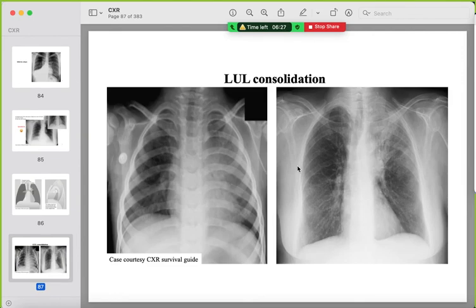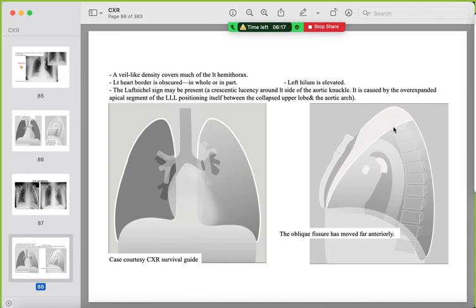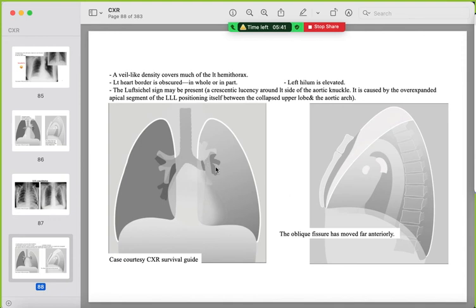Left upper lobe consolidation shows air bronchograms with no signs of collapse. Signs of left upper lobe collapse include a veil-like density over the whole left lung, loss of the left heart border, and the aortic knuckle surrounded by an air lucency (hyperlucency of the left lower lobe). This is called the Luftsichel sign — a very important sign for left upper lobe collapse.